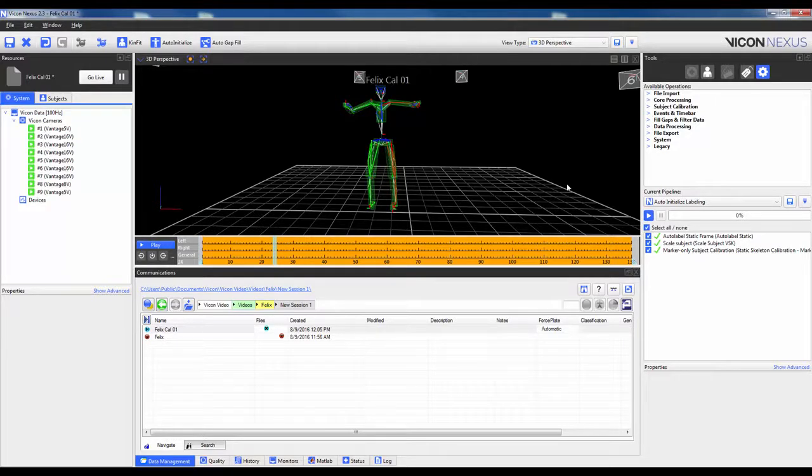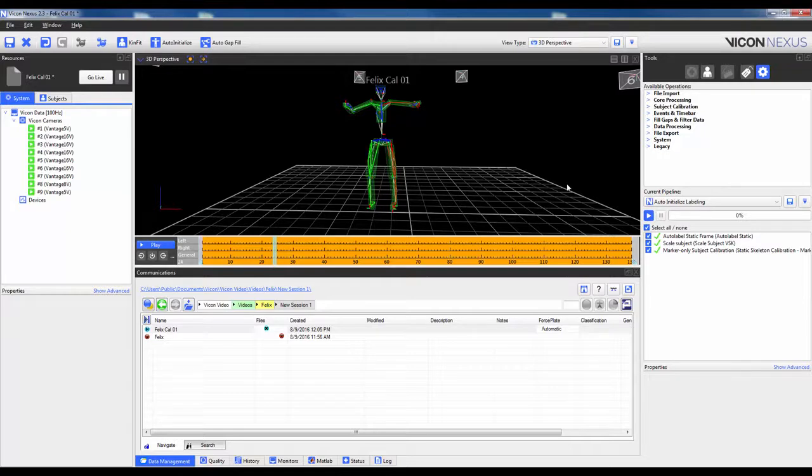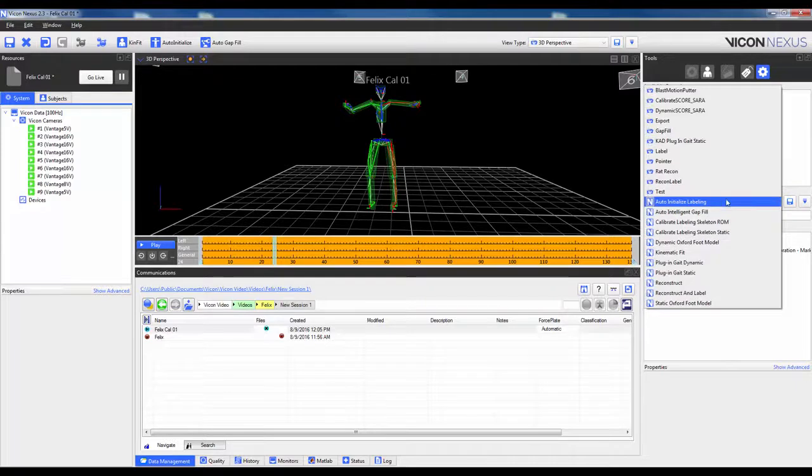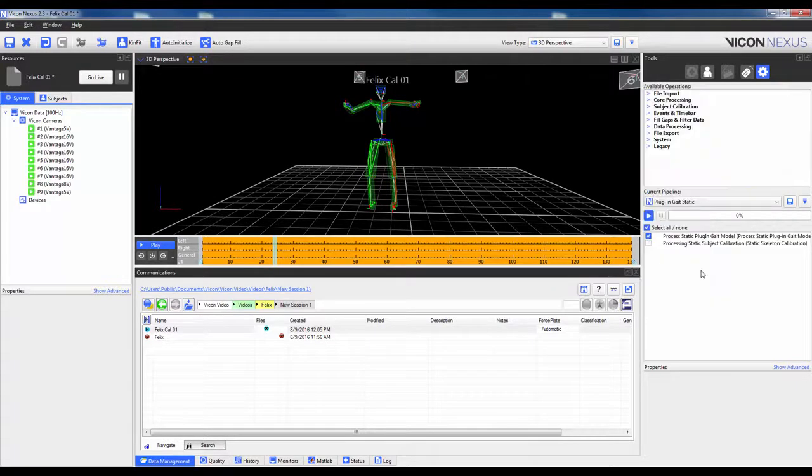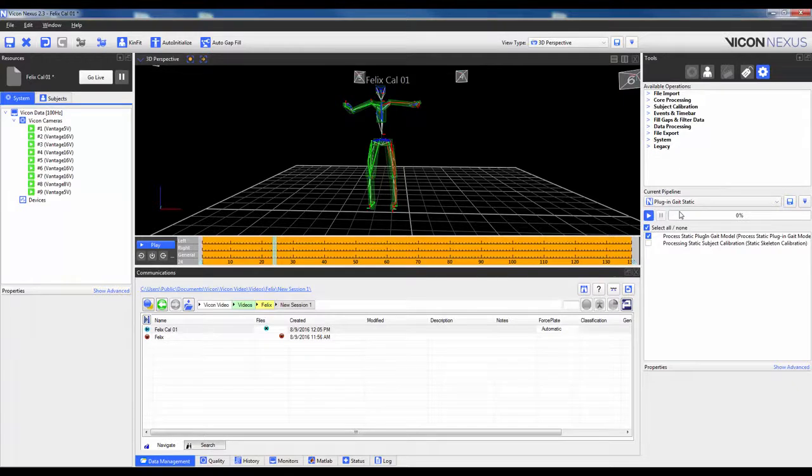Next we can apply the biomechanical model to this template to obtain biomechanical outputs such as joints, segments, and angles. To do this, we will switch the current pipeline to Plug-in-Gait Static. There is really only one operation, and that gets run as part of the pipeline.